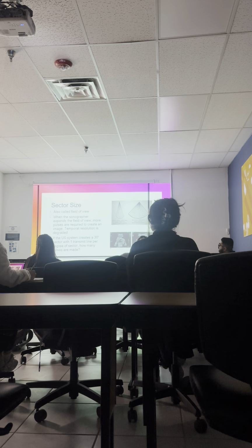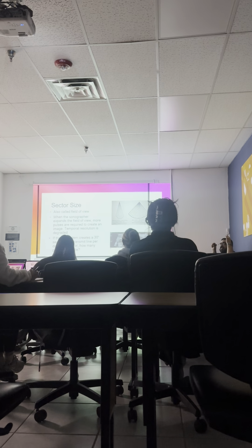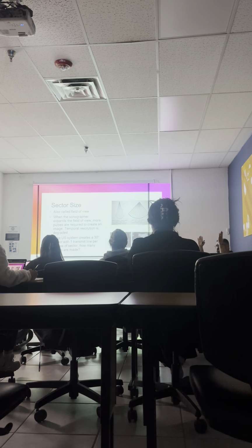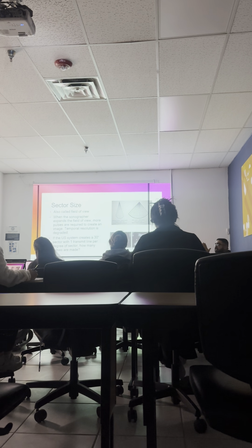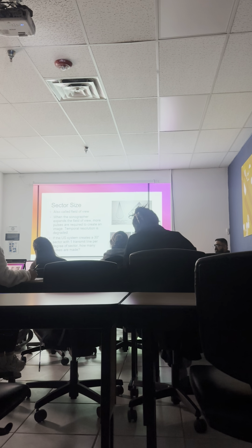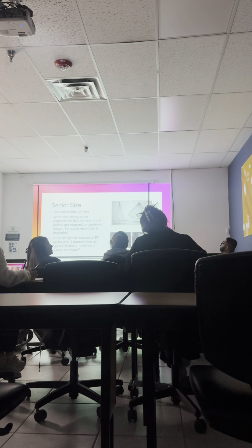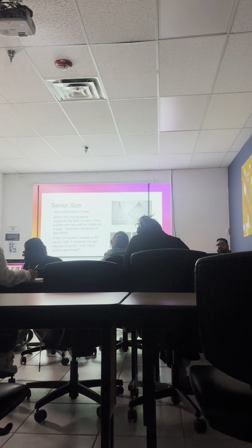No. So what did this sonographer do? She used the sector size small. Yes. Okay, so this sonographer changed the sector size, right? The sector size changed and it made our image look more defined. Okay, so look at the space in between the lines, between this one and this one.